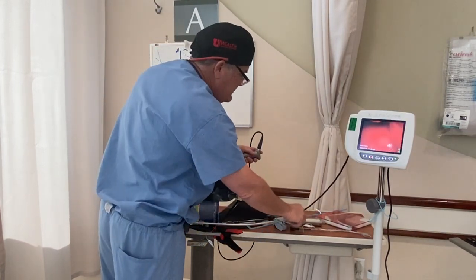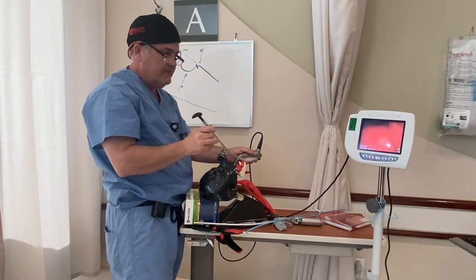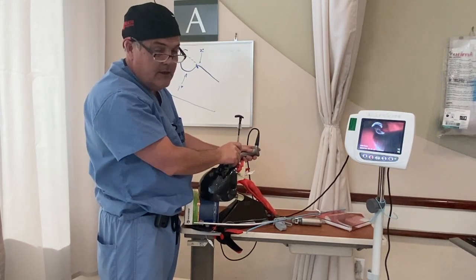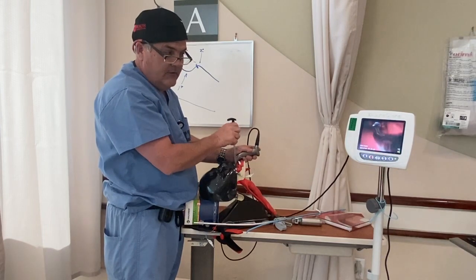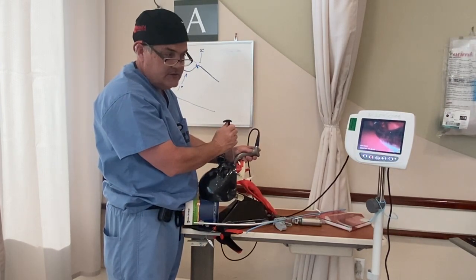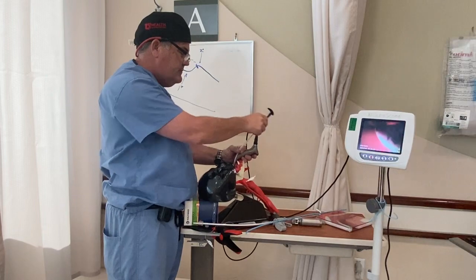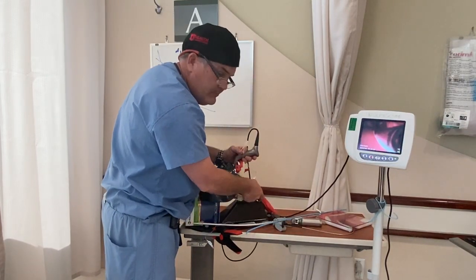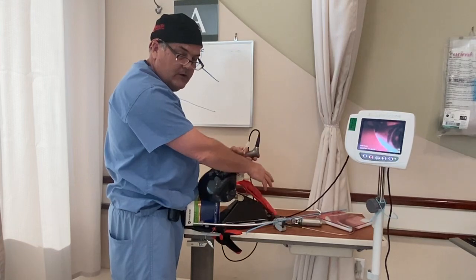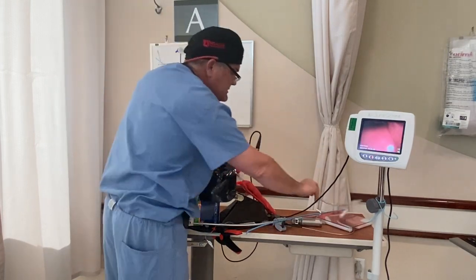I then have them use a GlideRite stylet, which is shaped just like the primary curve. This allows them to work around that primary curve, and now they can quite easily get the tip to the trachea. However, you can't enter the trachea directly because all the force is being transmitted up into the top of the trachea — you have to remove the stylet and push the tube forward to enter the trachea. Force on tissue is generally bad.